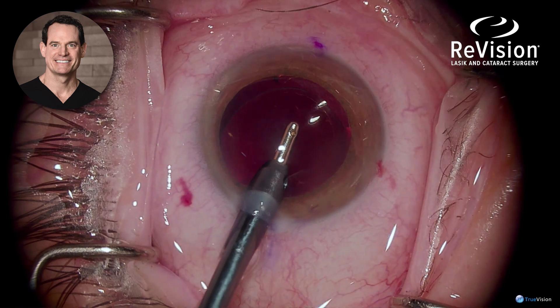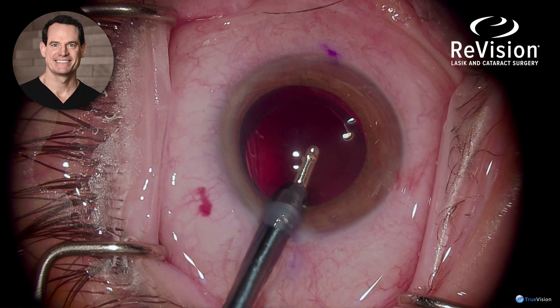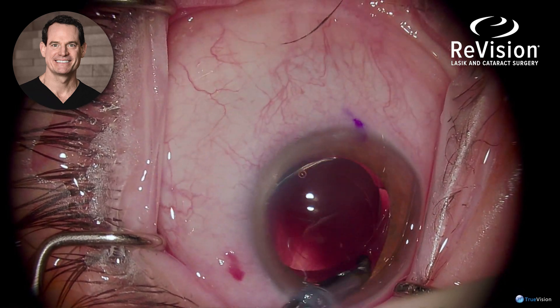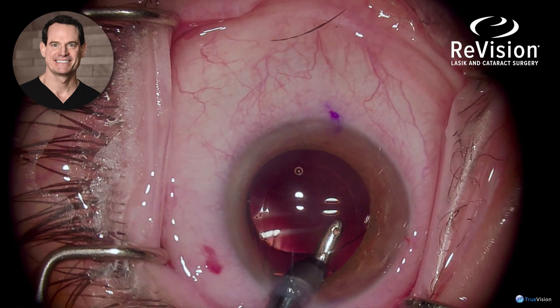Viscoelastic is then removed from the anterior chamber, followed by removal from underneath the lens, because the viscoelastic can be trapped beneath the lens. Turning the handpiece down and going under the lens ensures all the viscoelastic is removed to avoid post-operative intraocular pressure spikes.